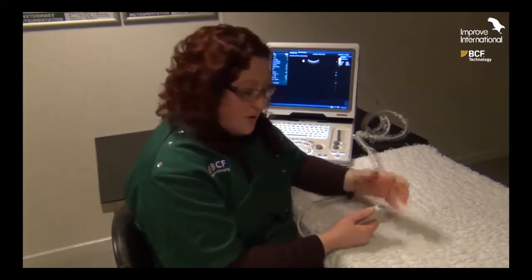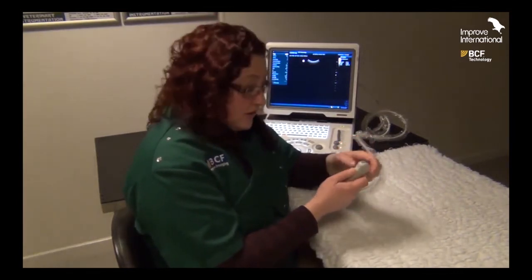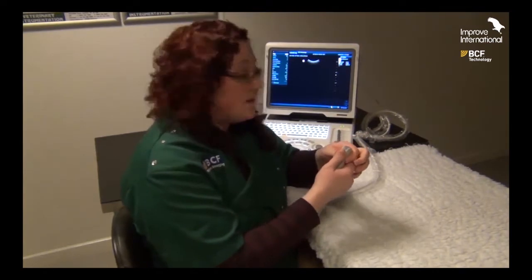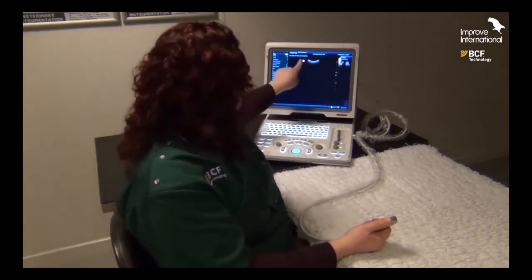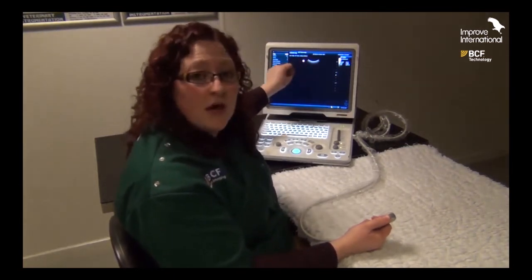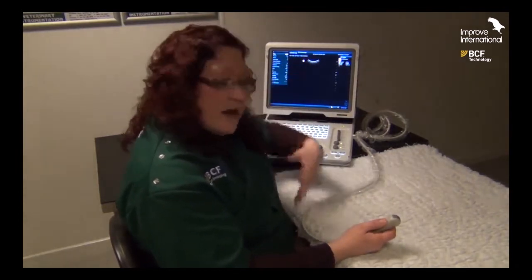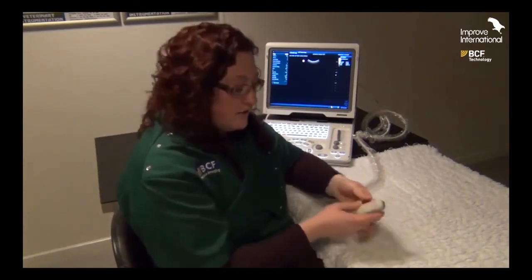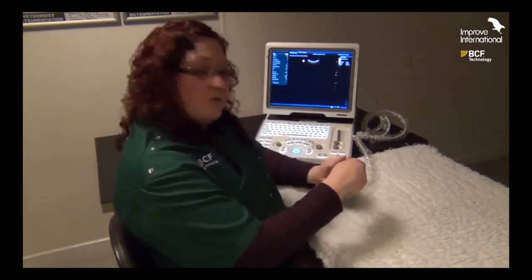Another feature is this little button called the thumb mark — on some other probes it's a notch or a groove — but basically it helps us to always orient ourselves in relation to the screen. This knob, where your thumb will be located, corresponds to a mark on the ultrasound screen. On this machine, the 'M' stands for the manufacturer Mindray, so it allows us to know at all times that this side of the probe will be displayed on this side of the ultrasound image.